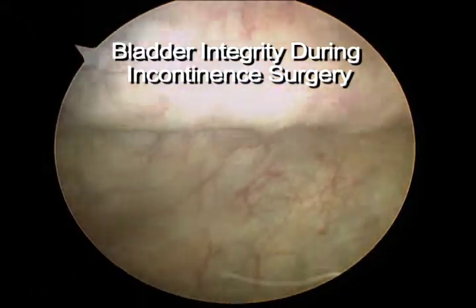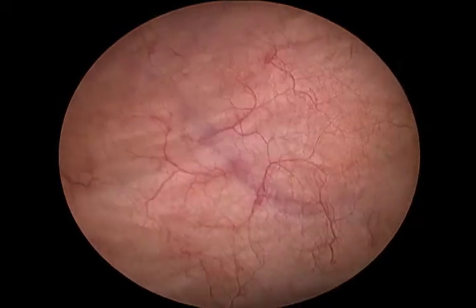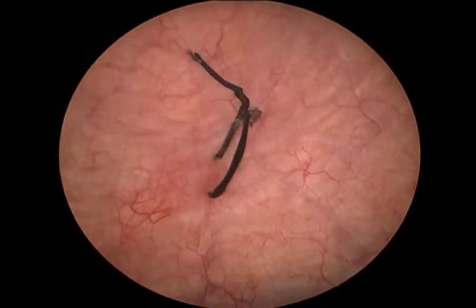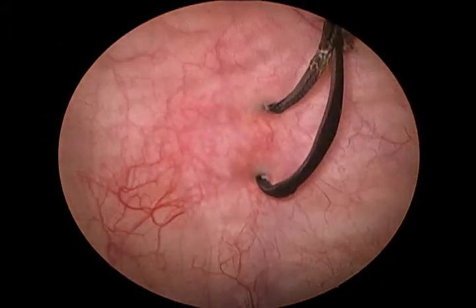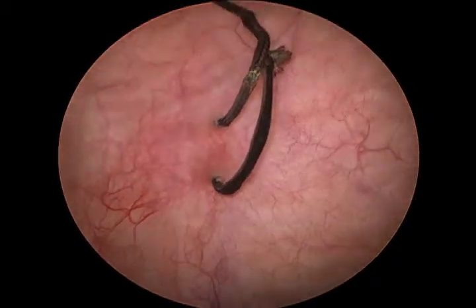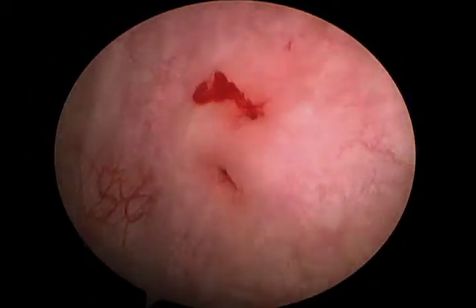Confirmation of bladder integrity is in some cases, such as a TVT sling, a required component of incontinence surgery. While this is not the case with other types of incontinence surgeries, the surgeon still benefits from assessing the bladder to ensure that a foreign body, such as this Burch suture from a prior urethropexy, has not compromised the integrity of the bladder. Having been discovered at the time of implant, this suture could have easily been removed. However, in this event, being discovered some time after her original surgery, operative cystoscopy was required to remove the stitch. The site from which the suture was removed can be seen here.